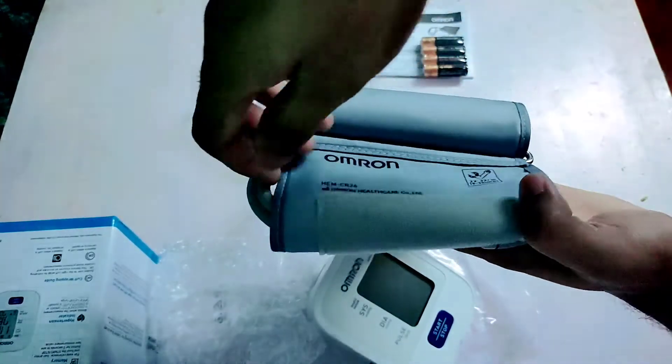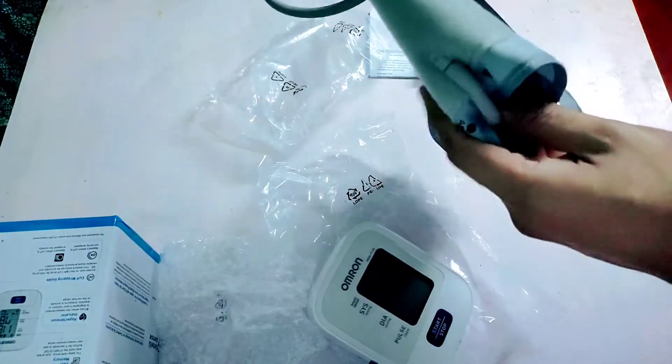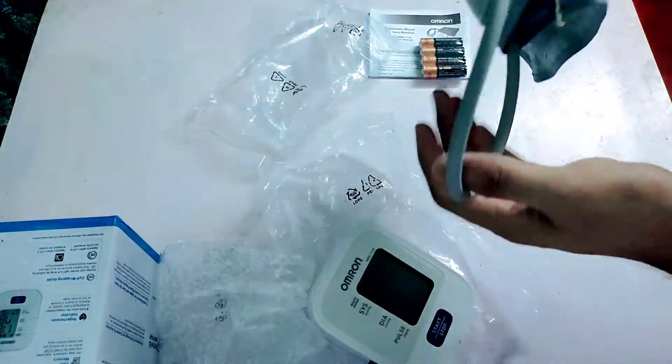They are available in three sizes: small, medium and large. Before placing an order, make sure you are choosing the right fit for yourself.